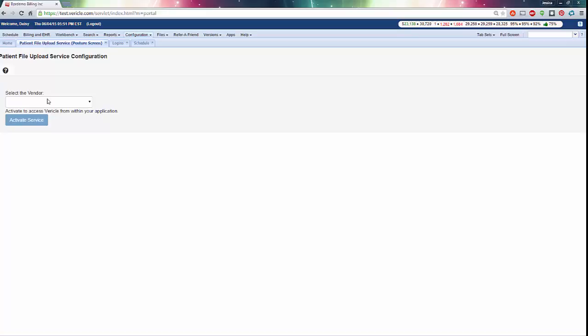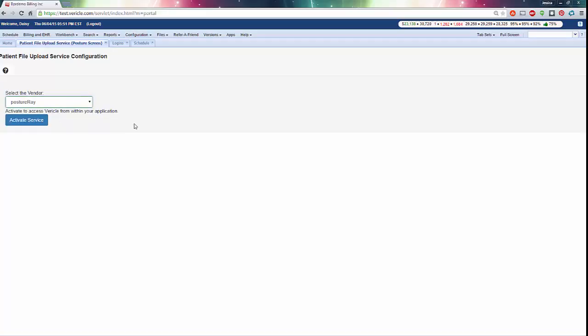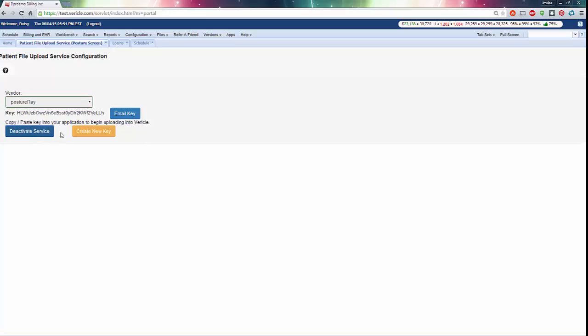First, select the vendor from the drop-down. We match on the vendor name and the key, so make sure you choose the right one. Next, click Activate Service to generate a key.